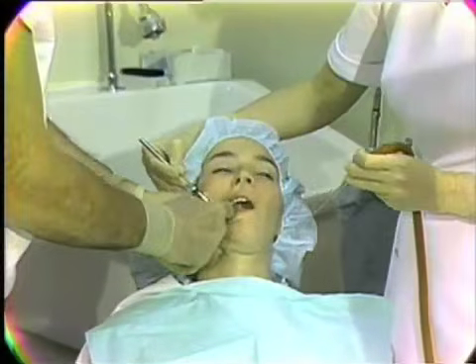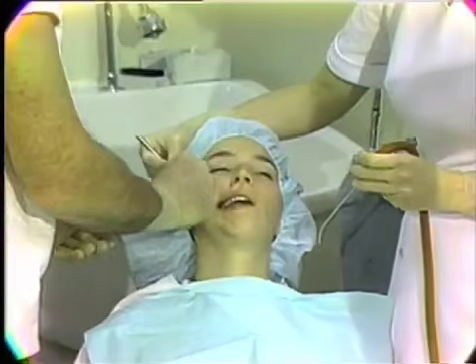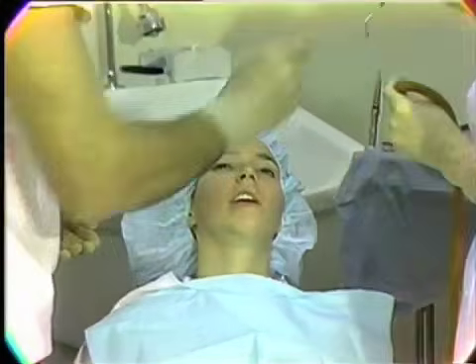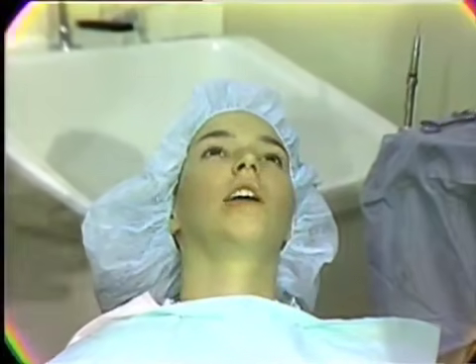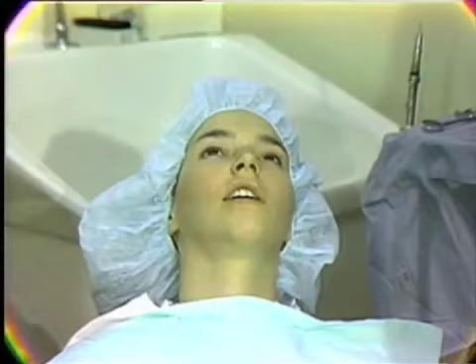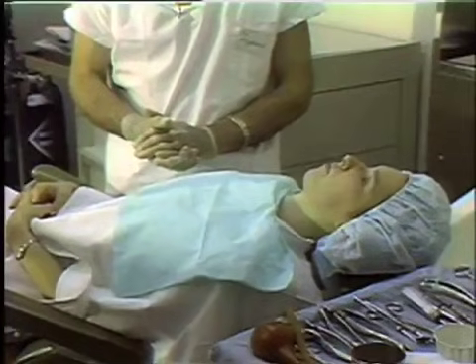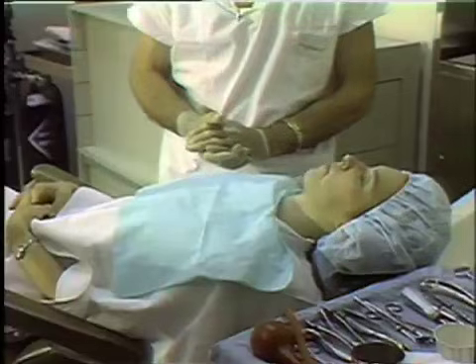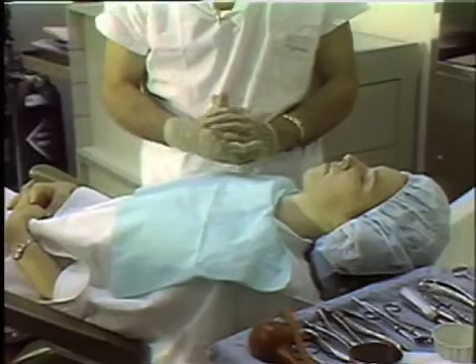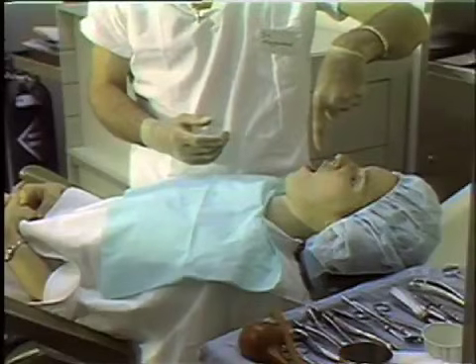So we have demonstrated the access around the circumference of the mandibular arch, and now we'll turn our attention to the maxillary arch, and we will change the position of the patient so that we can obtain access to the maxillary field. The patient has been repositioned for the approach to the maxillary arch. We will note that she's been tipped way back so that when her mouth is open, the maxillary occlusal plane is perpendicular to the floor.